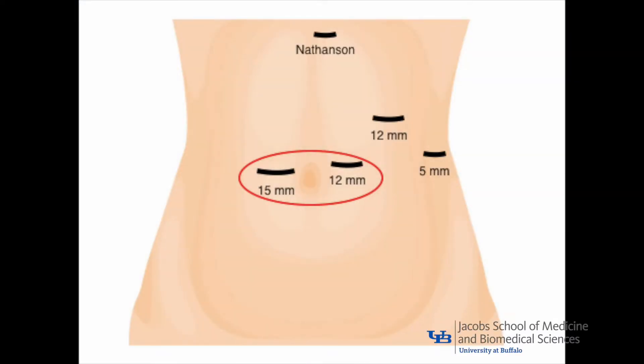When using the standard clamp technique, the 15mm and adjacent 12mm port sites should be placed slightly caudad in order to allow for the length of the clamp, which is inserted through the 15mm port site, and the angle of the stapler, which is fired through the 12mm port.